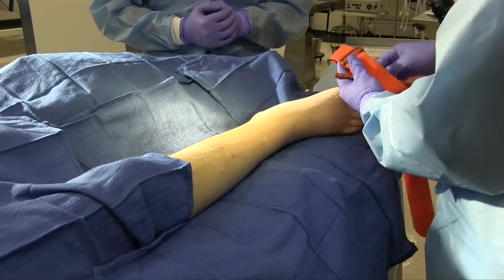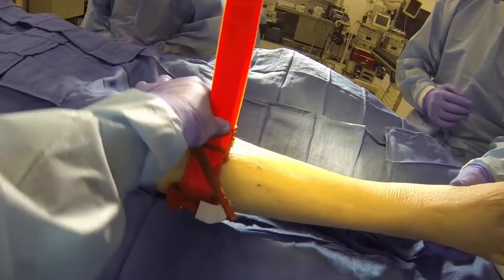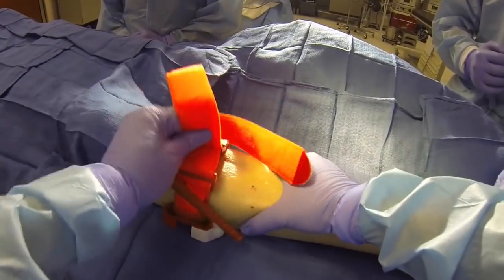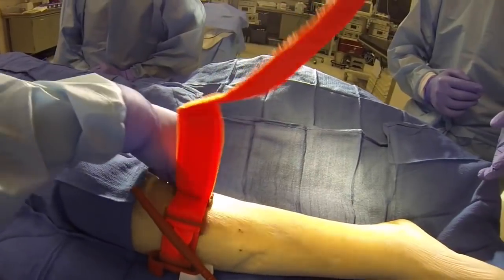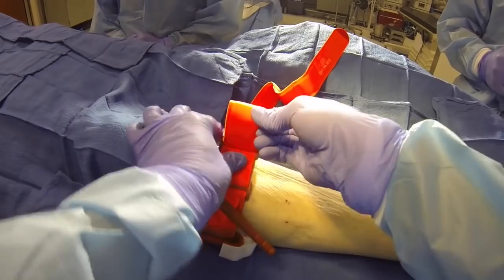Once you've decided that a field amputation is indicated and necessary, the next thing you'll have to do is place a combat application tourniquet. You want to place the tourniquet as far distal as possible on the affected limb, but proximal to the site of the proposed amputation, avoiding placement over any joints.